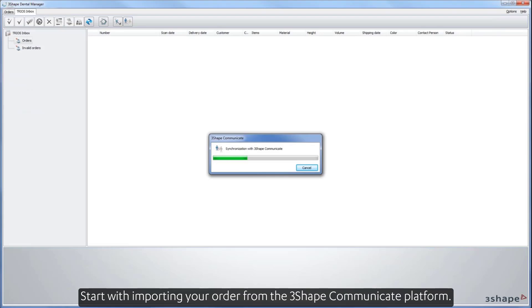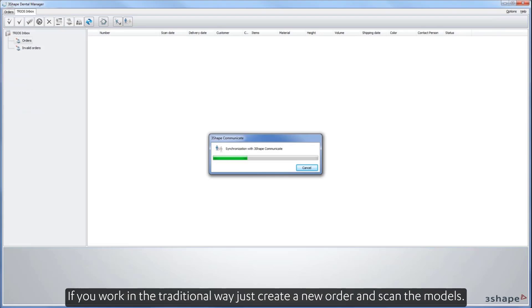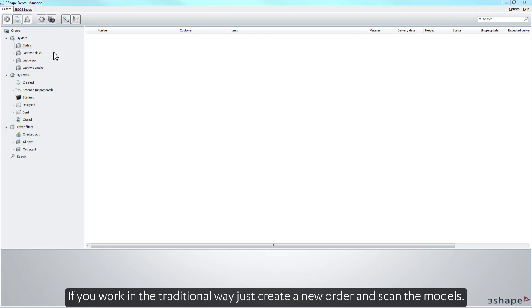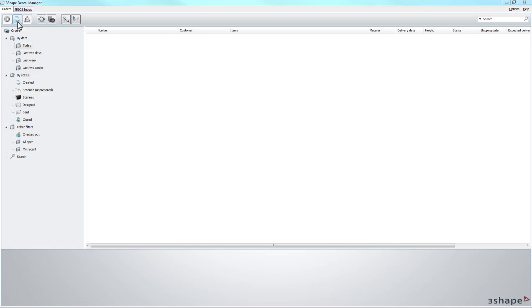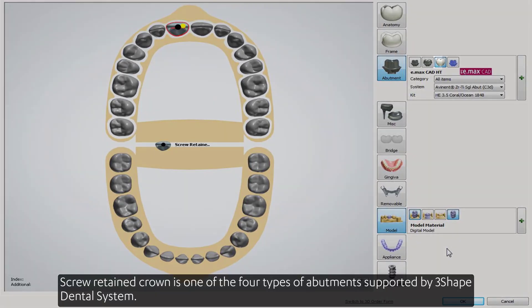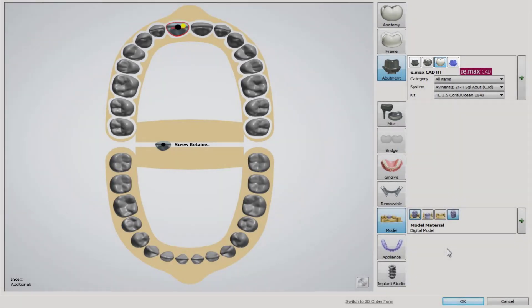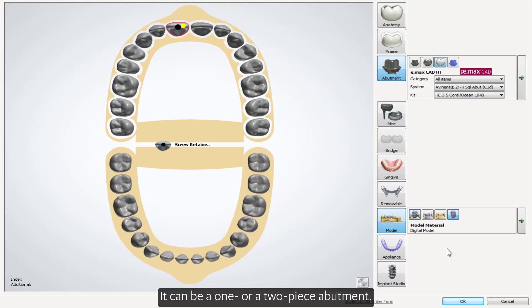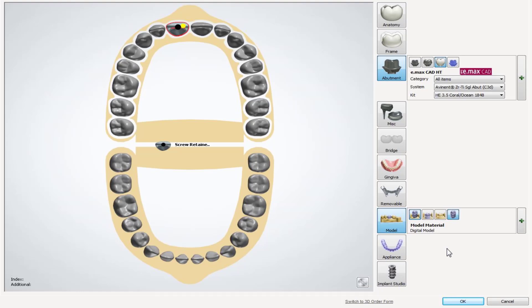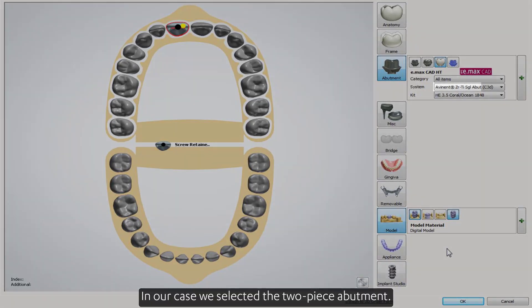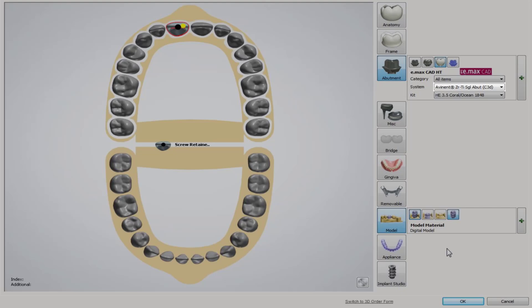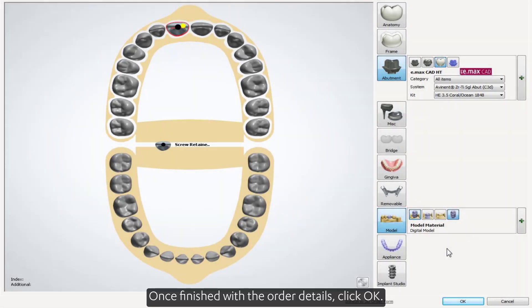Start by importing your order from the 3Shape Communicate platform. If you work in the traditional way, just create a new order and scan the models. Screw Retain Crown is one of the four types of abutments supported by 3Shape Dental System. It can be a one- or two-piece abutment. In our case, we selected the two-piece abutment. Once finished with your order details, click OK.